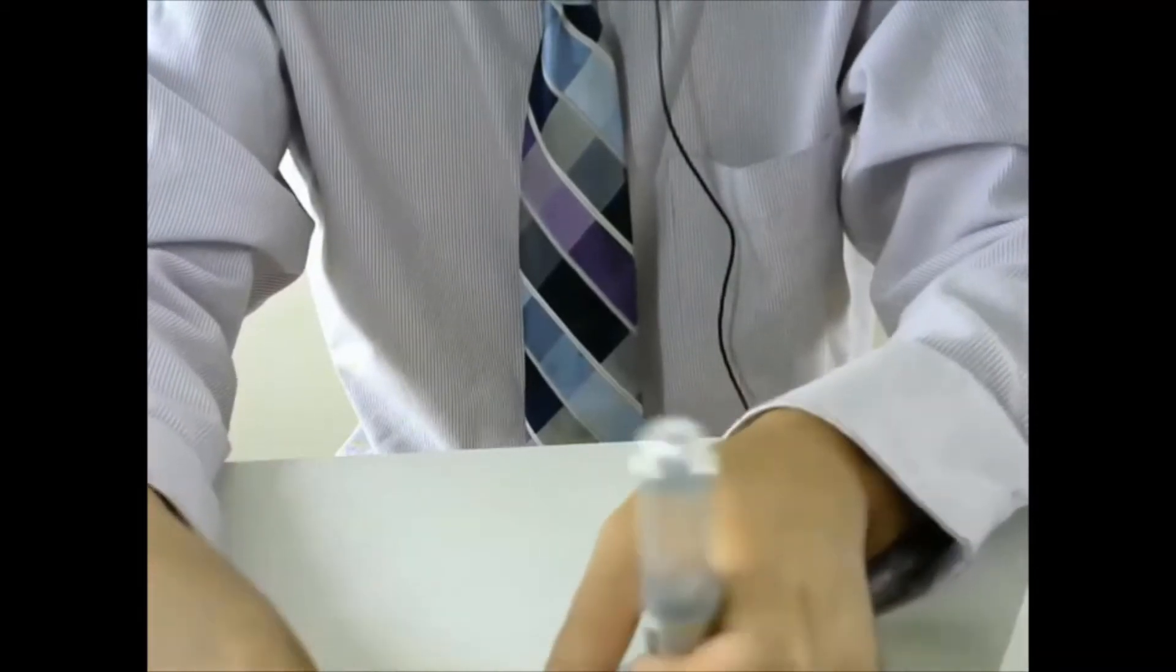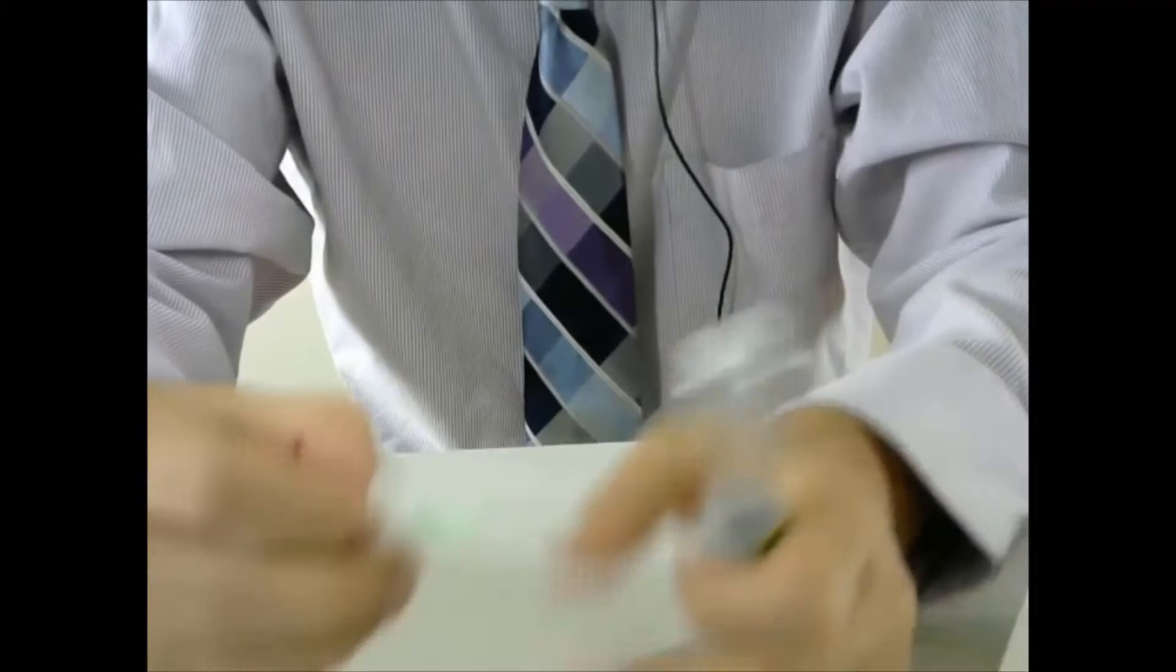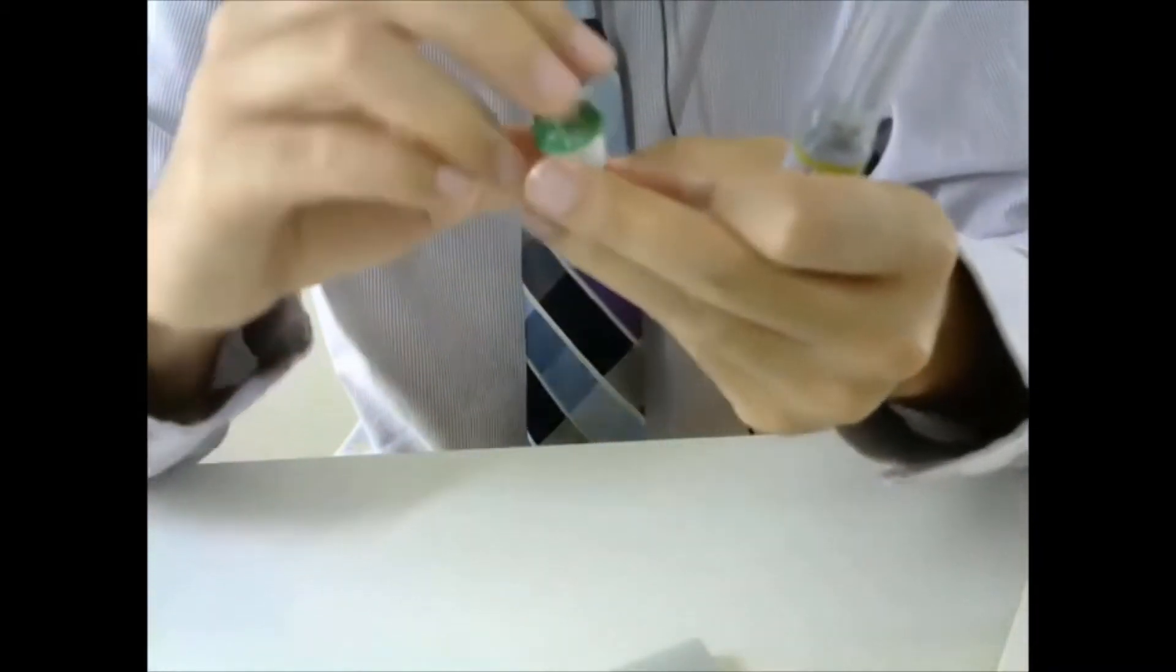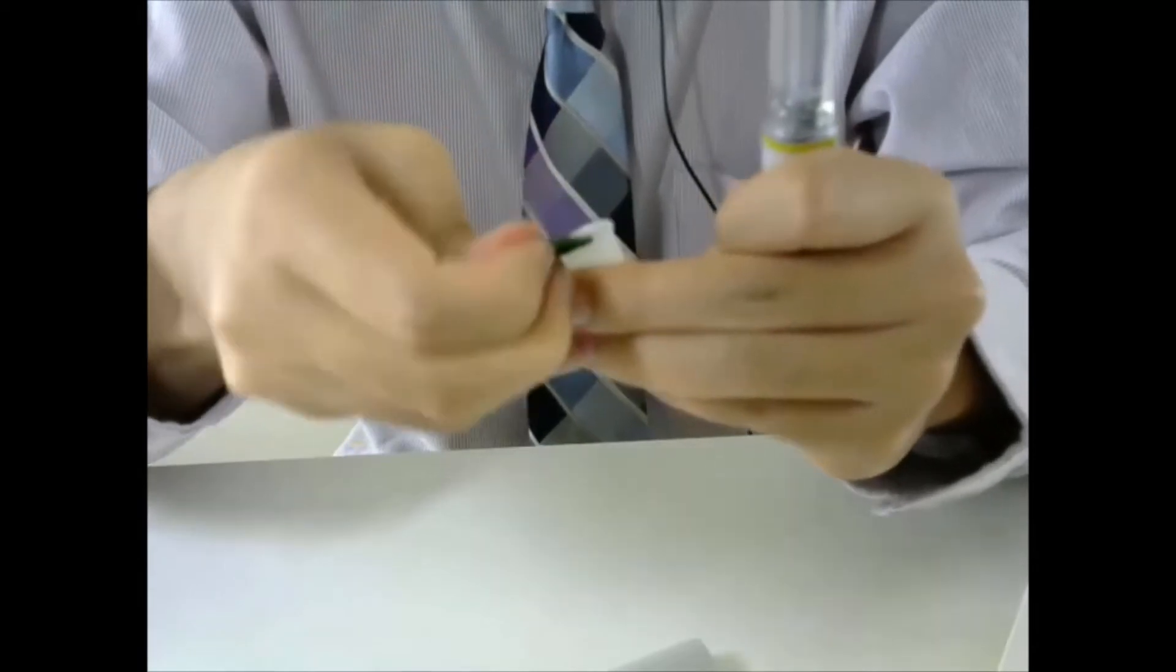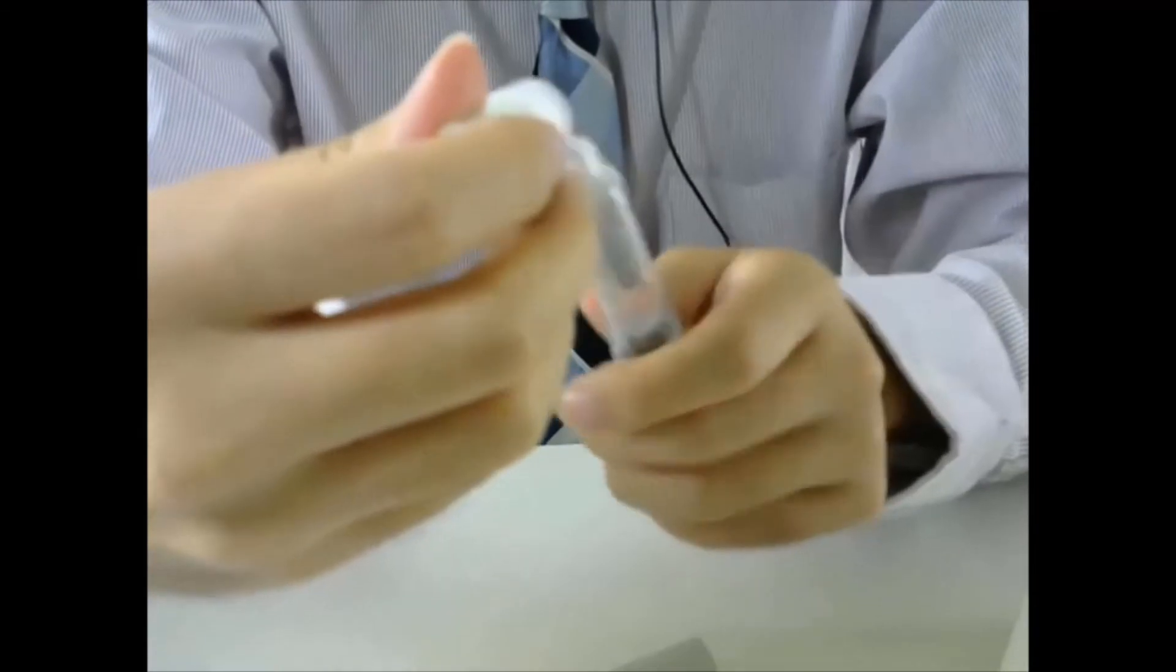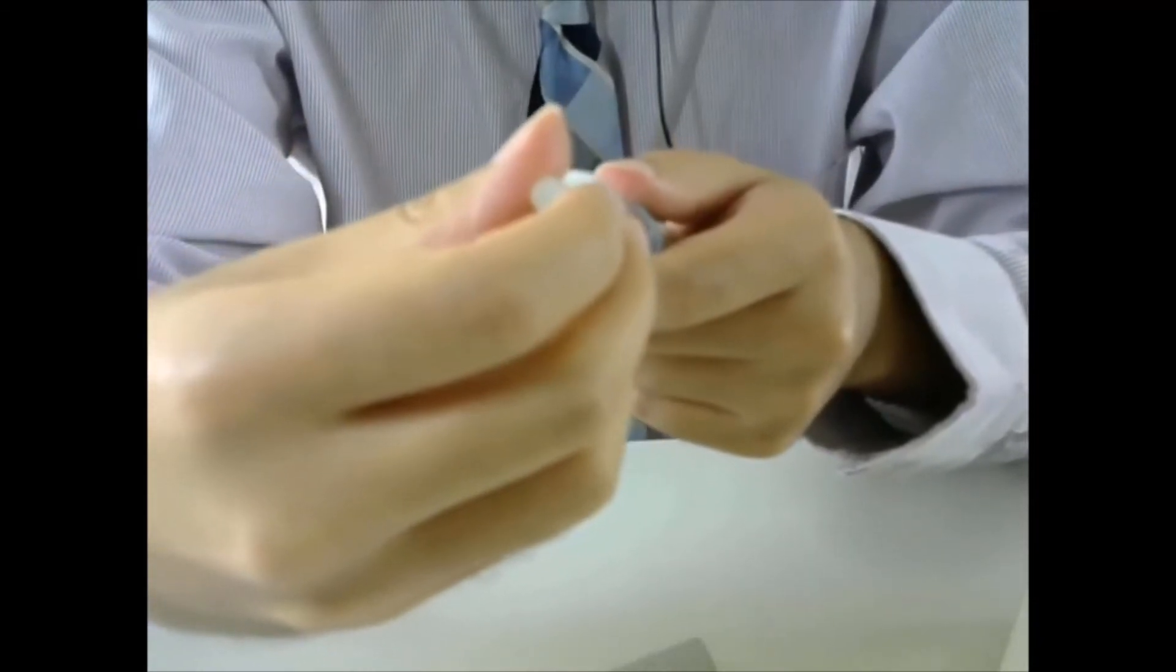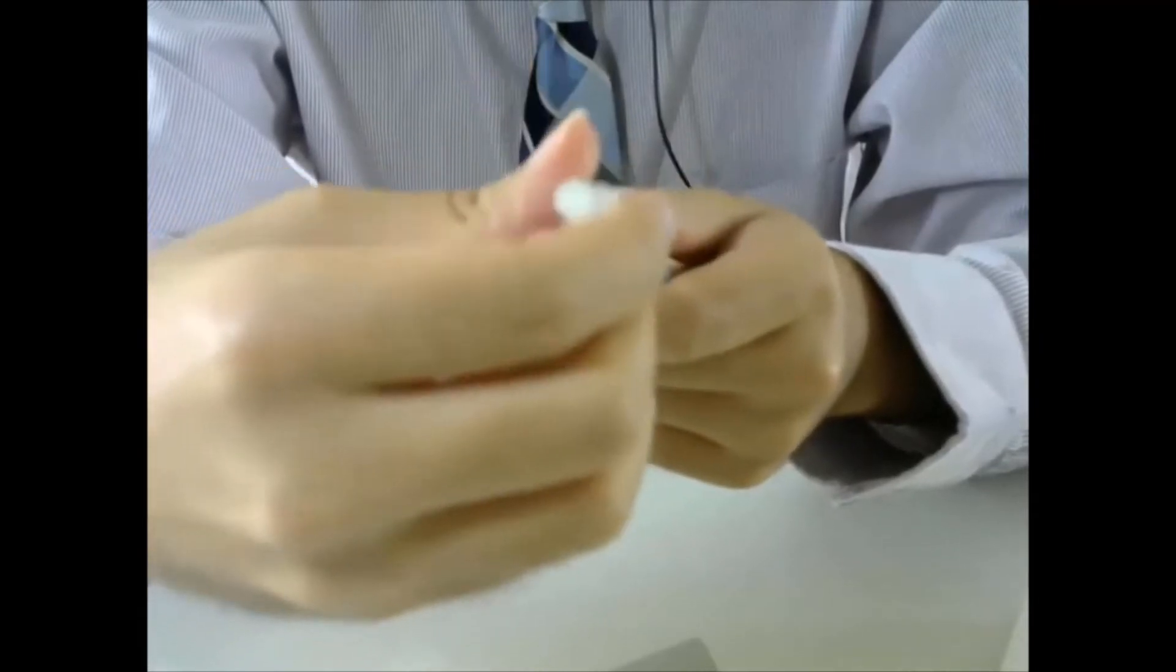The next step, we will need to put the needle on. Get a needle from the box. You can see the needle is inside. So push the needle onto the top of the pen and screw it in.